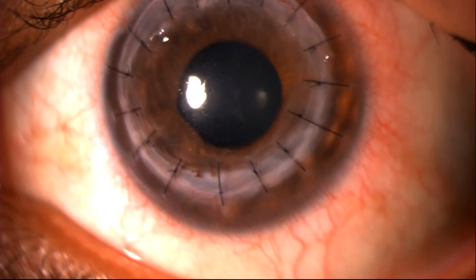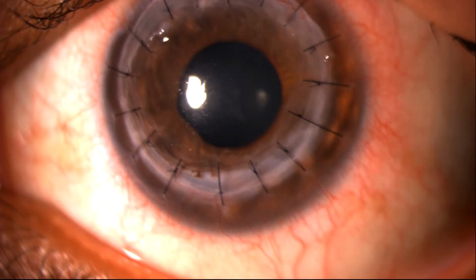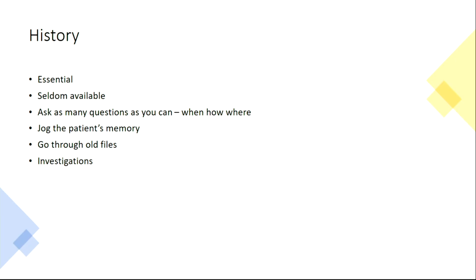For this patient, however, we did go for argon laser vessel occlusion. When you go for this laser occlusion, multiple sittings may be required, one sitting may not be enough. If you have access to a retinal laser in your setup, it can be helpful. The retinal surgeons can help us occlude the vessels. You can do it yourself, but multiple sittings of the laser may be required, and you need to assess the patient after a regular interval every time. This patient did undergo penetrating keratoplasty and is touchwood holding on well.